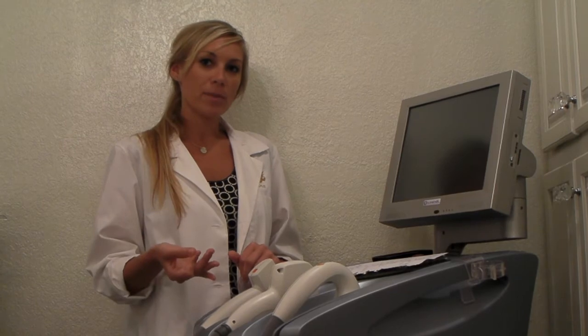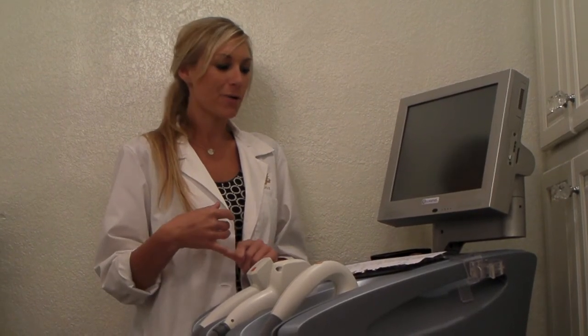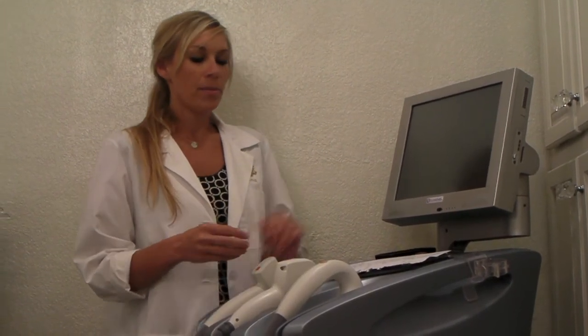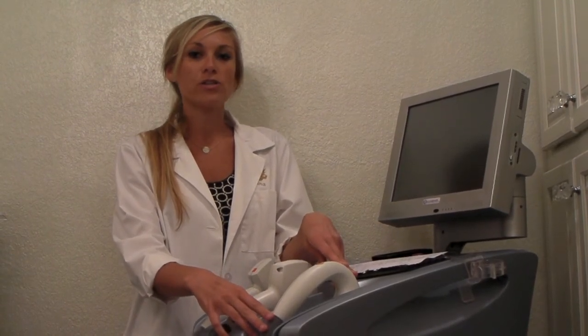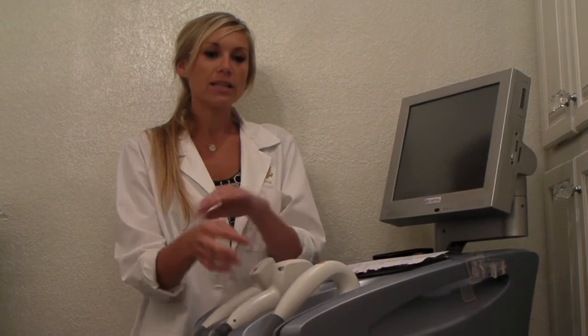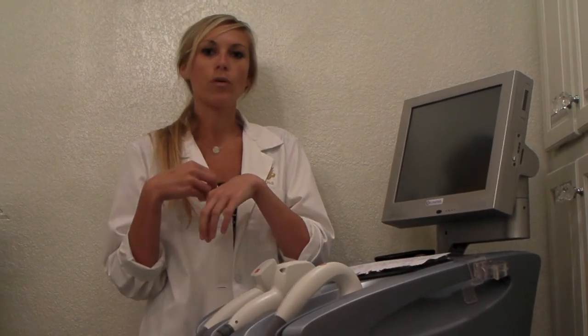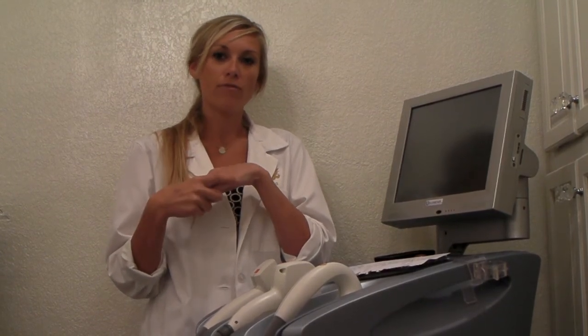If you're cleared by the dermatologist, whether you had to have a biopsy or he just looked at you and said it's okay, then the physician will go ahead with the okay. As far as the IPL, the major thing with the IPL is to make sure that you wear sunscreen during treatment. And most skin lesions, whenever he initially treats them, will become a little bit more dark. They will eventually crust and flake off.